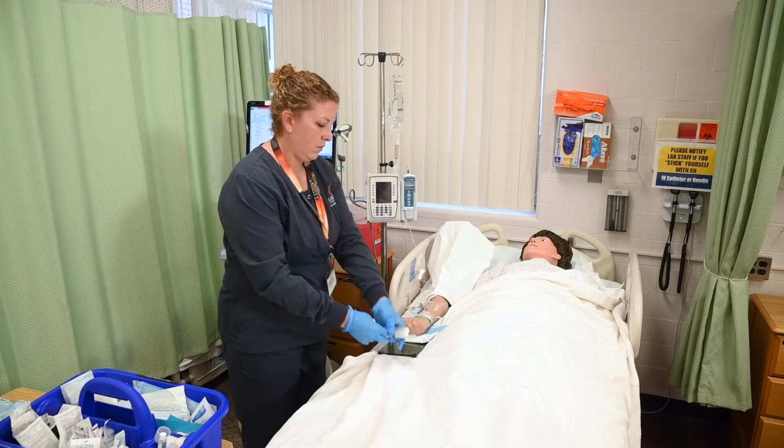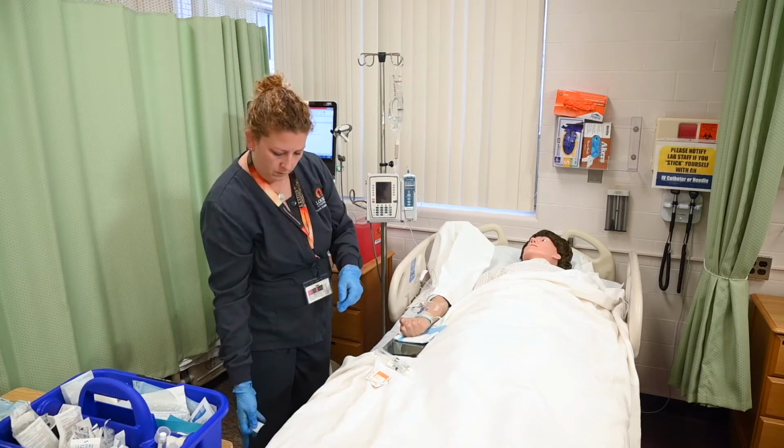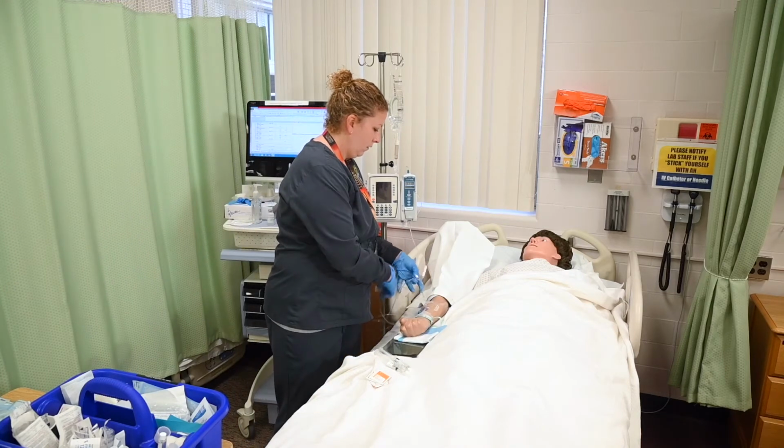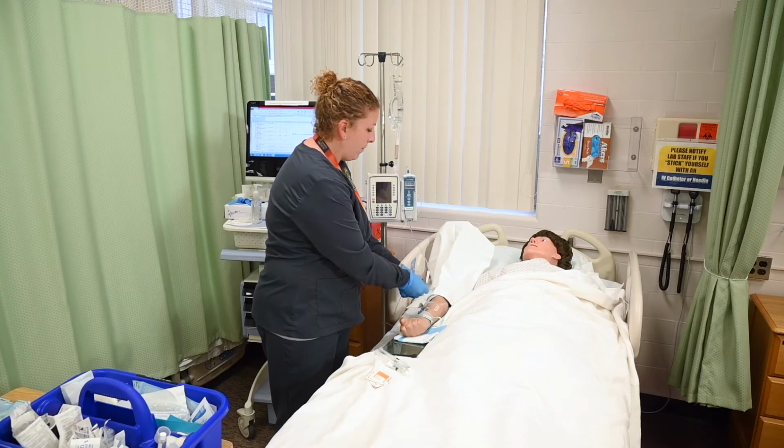Cleanse the injection port with an alcohol prep pad by scrubbing for 15 seconds and allow to dry completely. If an alcohol swab cap was present, I would not need to clean with an alcohol prep pad.